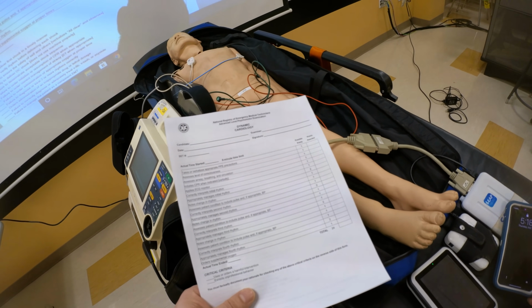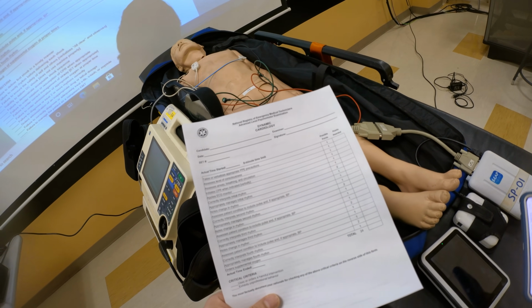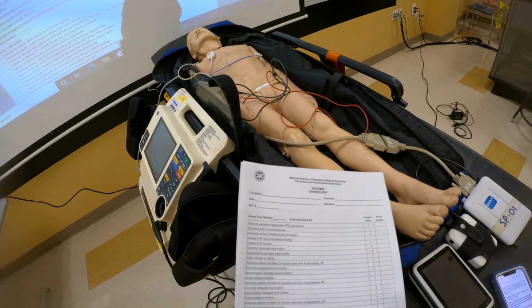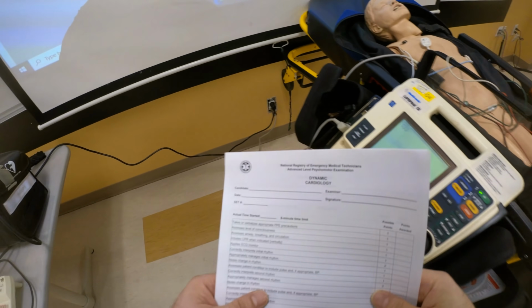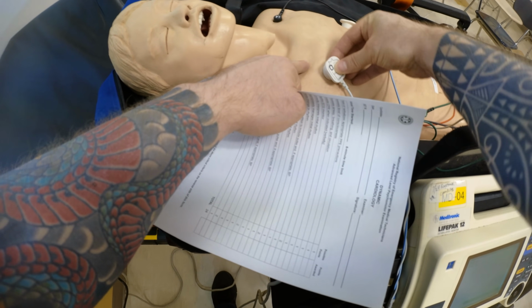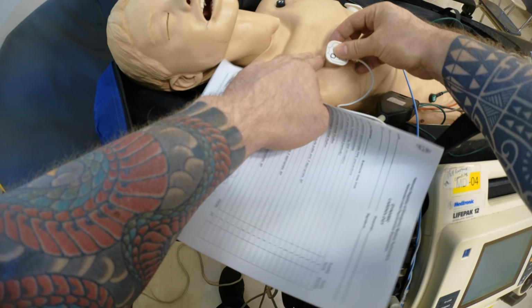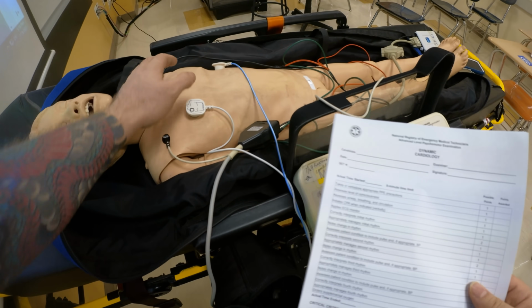The next thing that I want to address is how this station is set up, and this goes into the importance of this when you are doing this. You want to make sure that when you're connecting this and you let the student practice, they actually hear the clicks. I go over this in my video where I show you how to connect all this, but you want to hear the audible click and you want to make sure all the leads are connected.